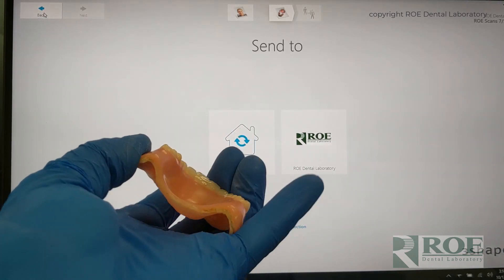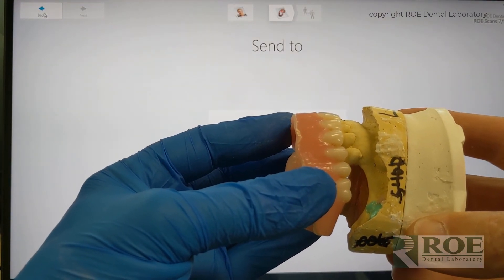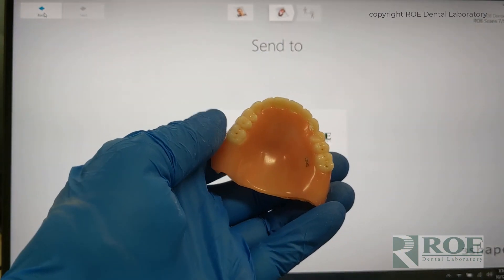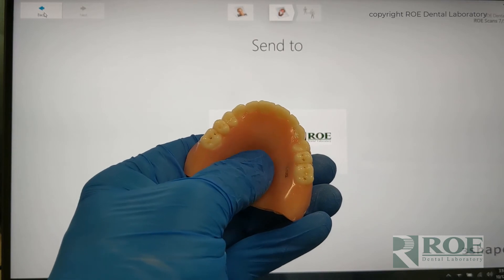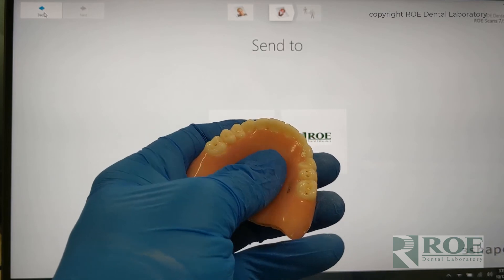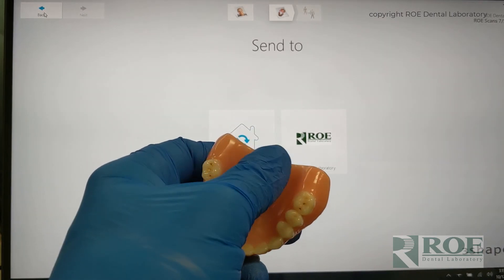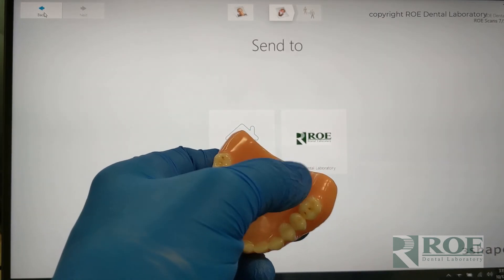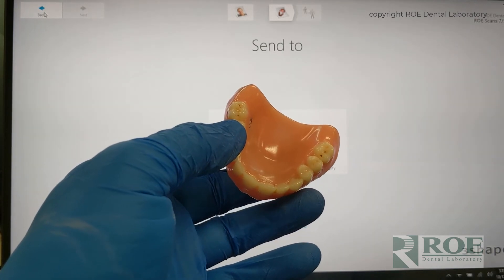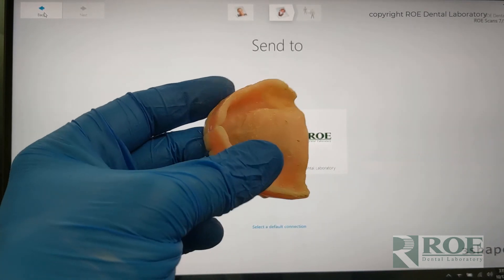We'll scan the denture and show you the trick while we're scanning. Then we'll scan the opposing and scan the bite. One of the challenges with scanning dentures is that the palate is shiny, and most scanners on the market will not pick up this shiny palate without trial and error and special materials. You can put a bite registration material on it or other products, but you can't use toothpaste or dull it up — it just seems to always fail. So we're going to skip it and show you during the scan.